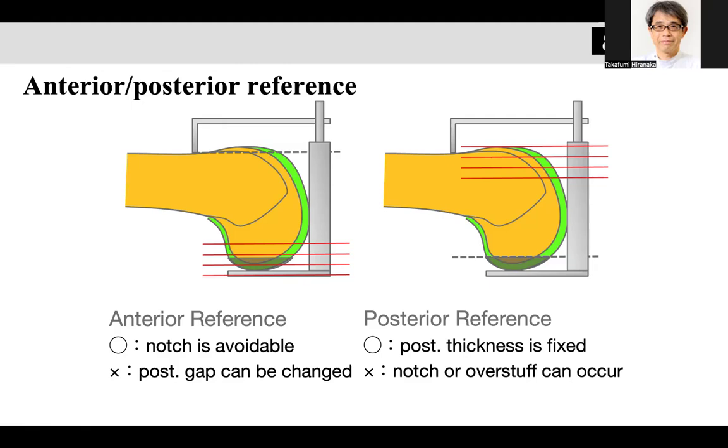I prefer to use anterior reference, but most kinematic users prefer posterior reference. The anterior reference is focused on the anterior cutting surface.